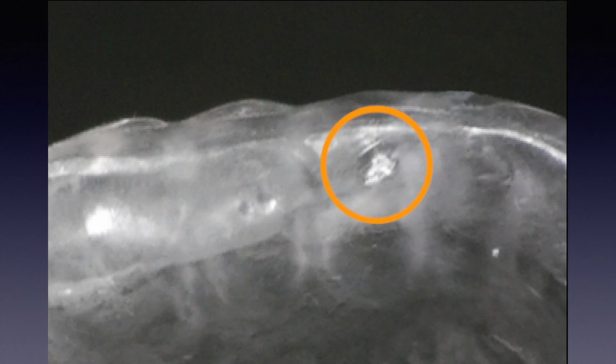This is the fossa which houses the lower first premolar cusp tip. In other words, by definition, it is the VHF, the vertical holding fulcrum fossa, or the disclusive fossa, depending upon which function it is providing. The yellow area is the deepest part of the fossa, and that is absolutely off limits. You never, ever deepen it. It maintains the vertical during the adjustment process. That's why it's called the vertical holding fulcrum.